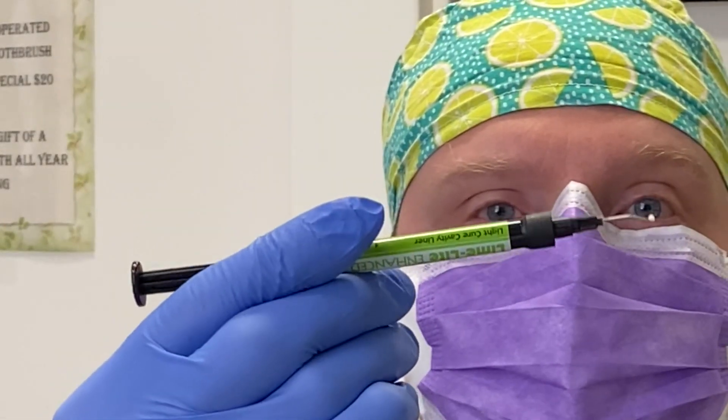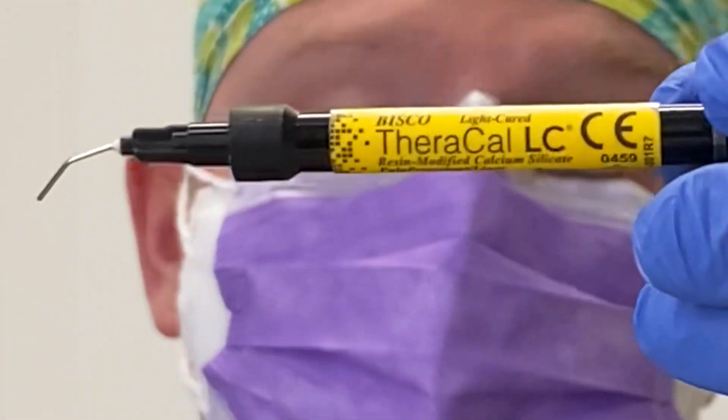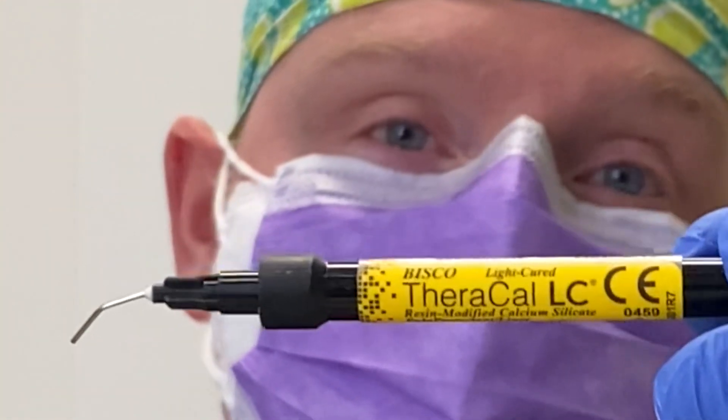Thanks again for joining me today in this video where I was showing you how to use Limelight, which is one of our liners — you can see a bead right there. As I mentioned, we have a whole bunch of others. One of which is called Theracal, another great product that we use as well. Sometimes when things are extremely deep, I will use both to give a double layer of insulation and help prevent sensitivity — especially changes in temperature and general sensitivity from the procedure and the materials we use.